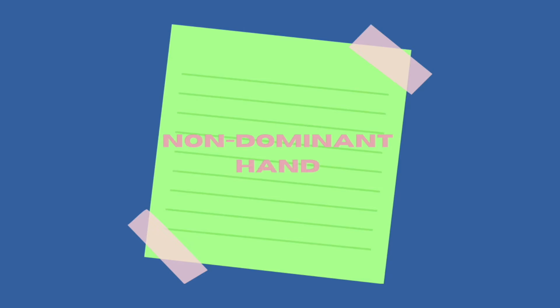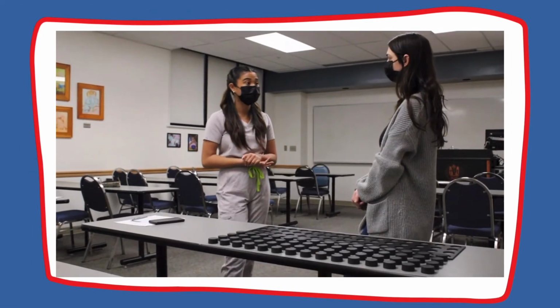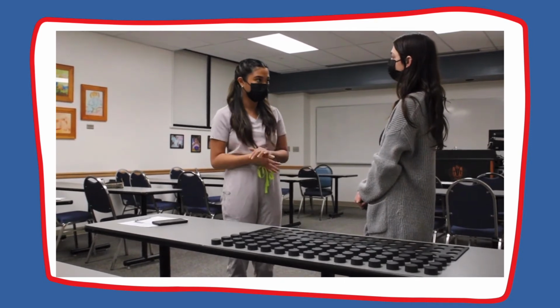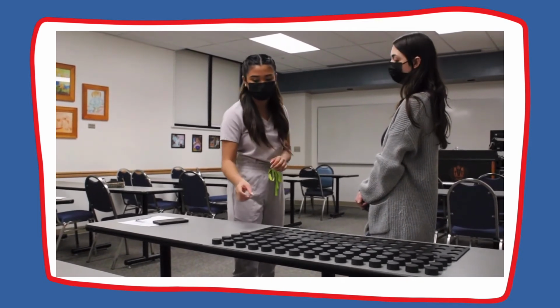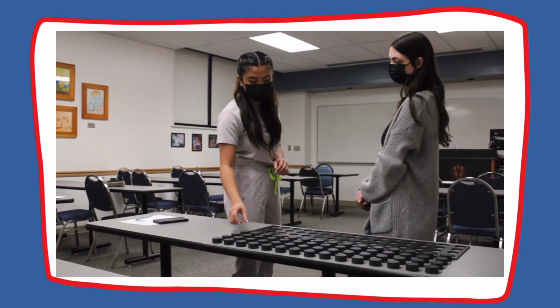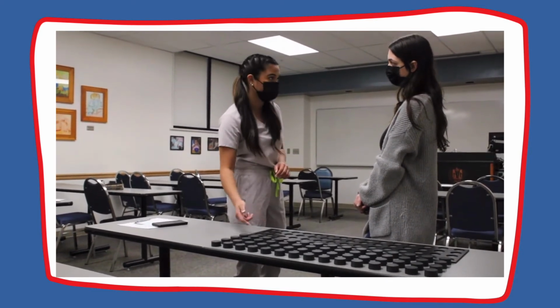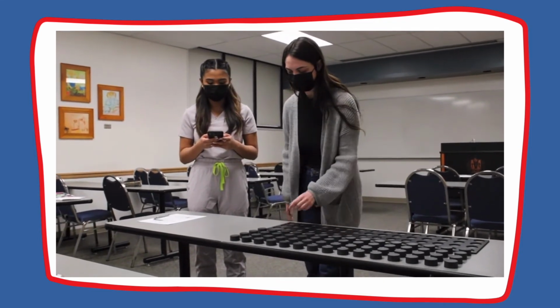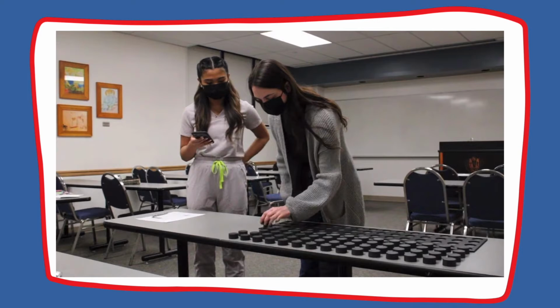Non-dominant hand. With your non-dominant hand, we're going to test your left hand now. So you're going to do the same thing. I'm just going to be placing the disc again into the holes, and I'm putting it in the same column as well. Okay. Ready?